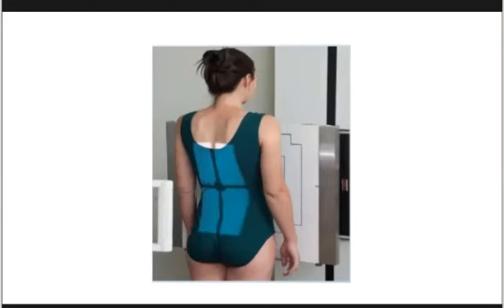Because maybe we collimate, but in the book it says collimated. But when we are evaluating scoliosis, the central ray should not be collimated. Rather, the tube should not be collimated, because the curvature may be large and our x-ray will be cut off. So that is just an example of the PA upright for the demonstration of scoliosis, which is known as the Ferguson method.